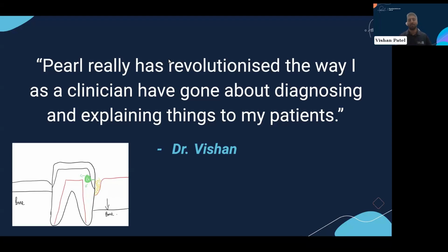In terms of root treatments, it's interesting to see the radiolucency. So that comes up, and you can see the periapical radiolucency in a light blue. Sometimes when you're looking at an X-ray and telling a patient, look, it looks a little dark around the apex, because it puts it into color, that helps a patient understand, okay, look, I've got an infection.